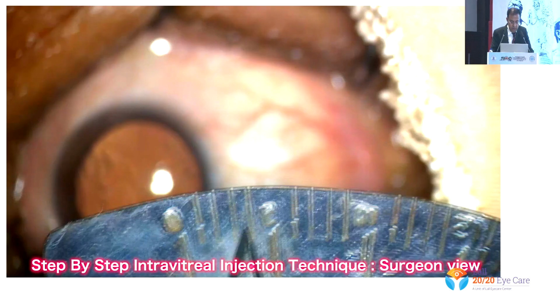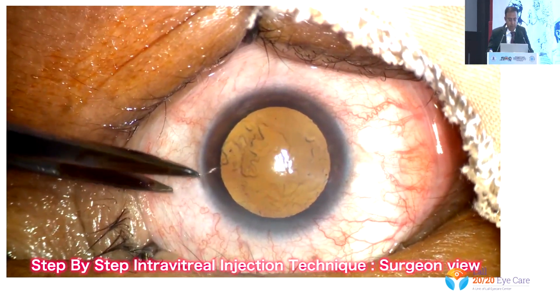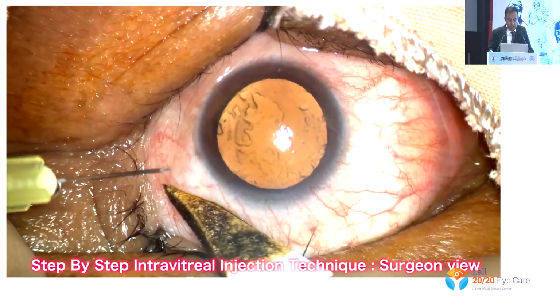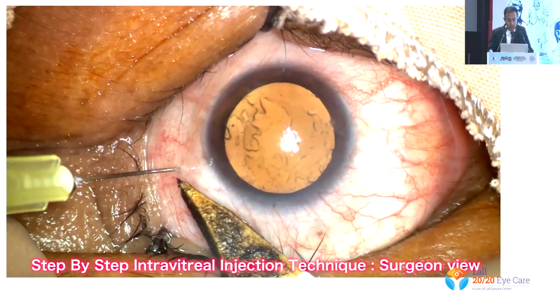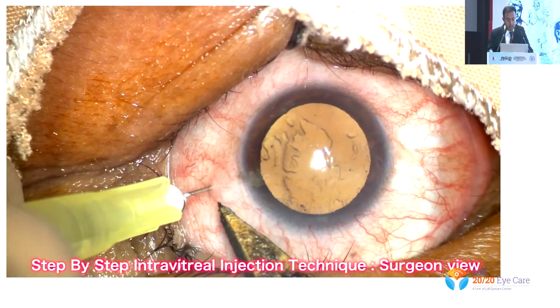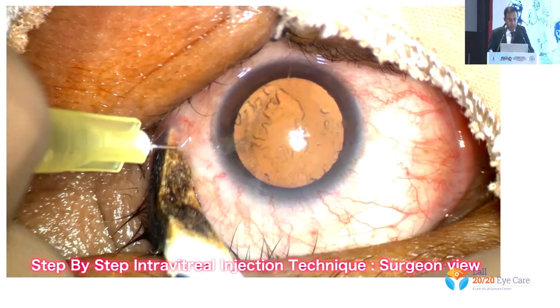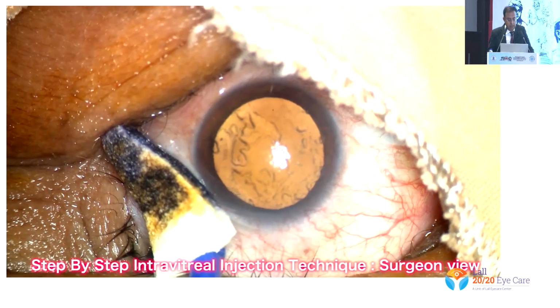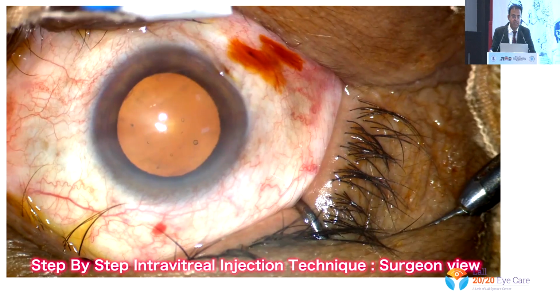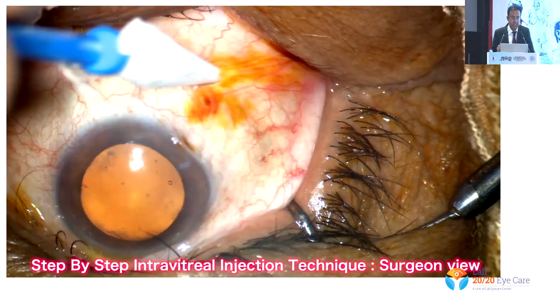This is the surgeon view. Again, I would like to say that this is 3.5 mm. Just mark it with betadine. You can see here, we are just going inside, directed into the center, and we can see the flow of this. This is how you need to put the conjunctiva back. We need to see whether there is any vitreous wick coming out of that hole. In case it is there, we can cut it.